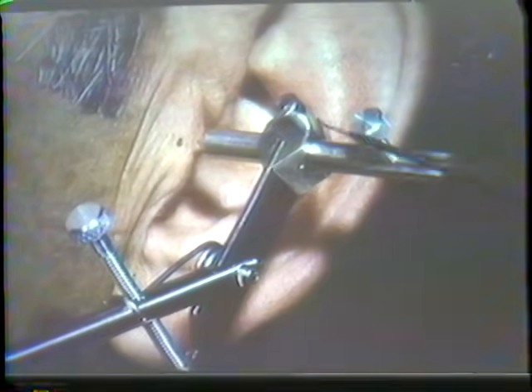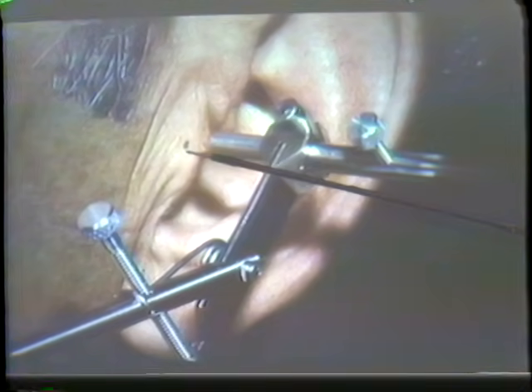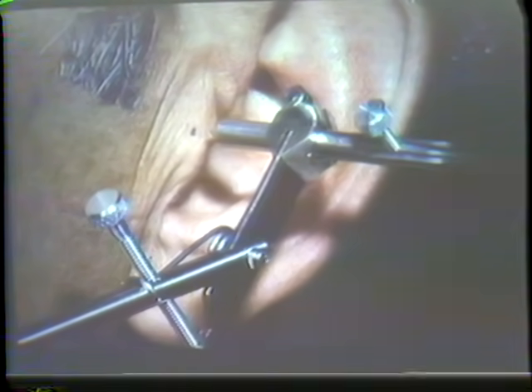We mark this on the side of the face. First, of course, on the card, but we take the card away and then mark it on the face, and this now becomes a hinge location. If we do it on both sides, then of course we have a hinge axis with which to make a transfer to an instrument. Again, providing the instrument is so designed that it will accept this hinge transfer or hinge bow transfer.